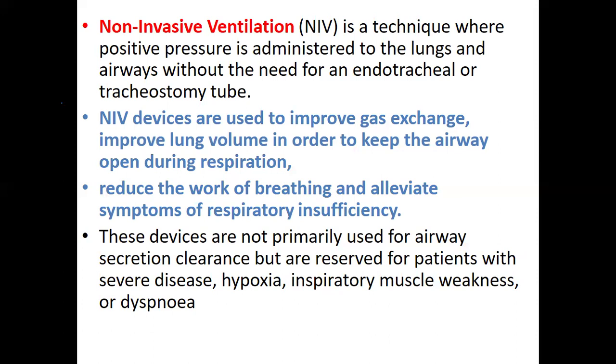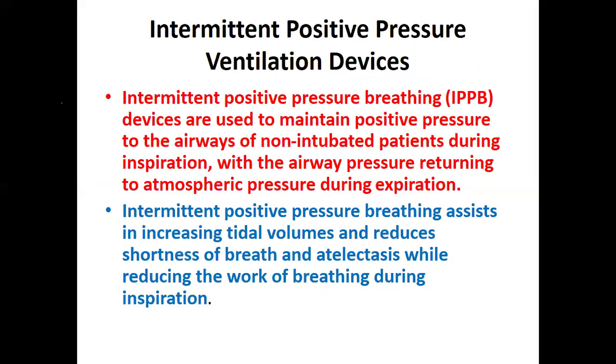They are non-invasive, by the way, so take note of that. These devices are used to improve gas exchange and improve lung volume in order to keep the airways open during respiration. They reduce the work of breathing and alleviate symptoms of respiratory insufficiency.